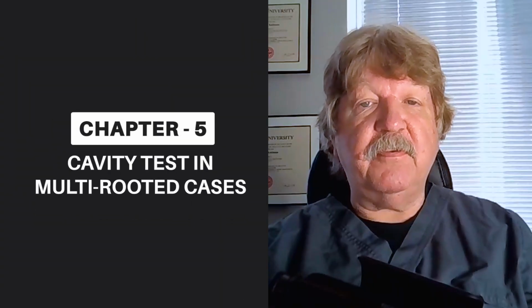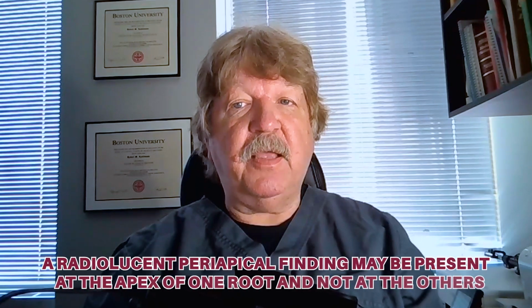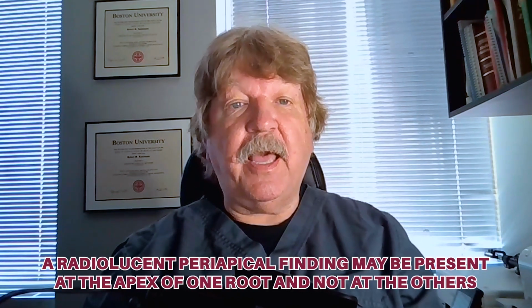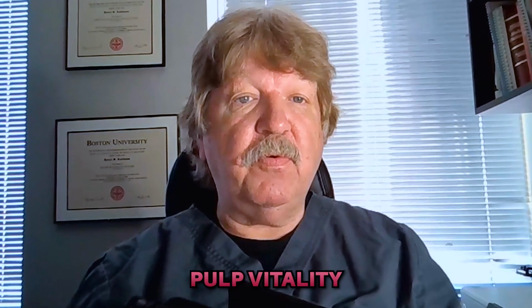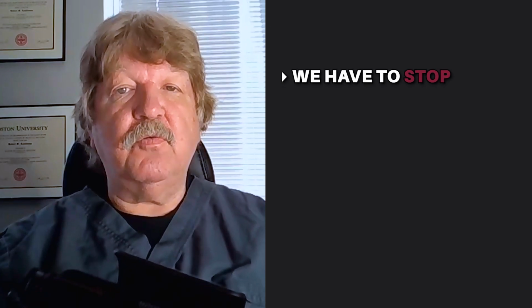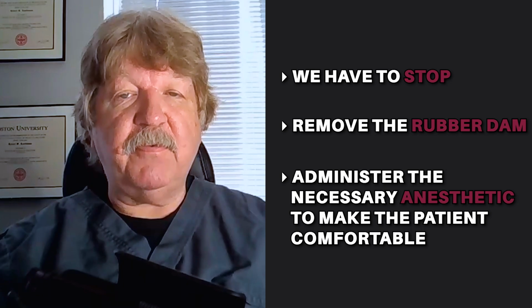In multi-rooted cases, the situation can be more complicated. We know that endodontic disease generally proceeds coronally to apically, and a radiolucent periapical finding may be present at the apex of one root and not at the others. This can indicate pulp vitality remaining in the other root with no finding. In those cases, we must administer an anesthetic to make sure the patient is comfortable. In all cases, should the patient have any sensation at all, we have to stop, remove the rubber dam, and administer the necessary anesthetic to make the patient comfortable.